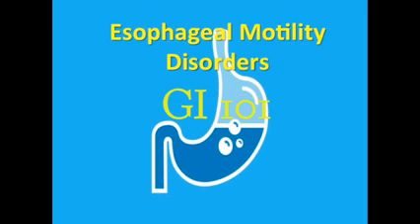I'm certainly fascinated by this topic, but is it really appropriate for all of our listeners? Well, in this episode, we are going to drill down into some fairly granular details about esophageal manometry. And this is probably more than what the average medical student needs to know. However, if you are a gastroenterology resident or a general or thoracic surgery resident, I think you will find this podcast useful.